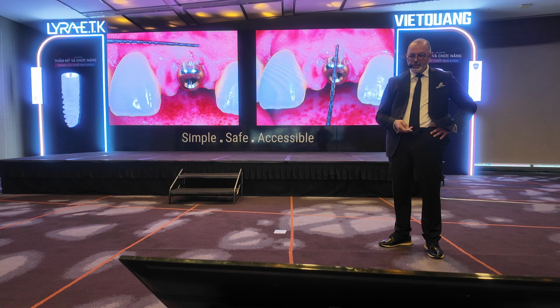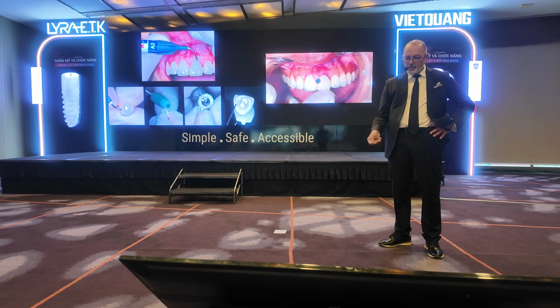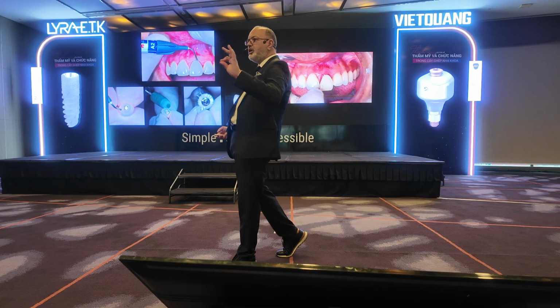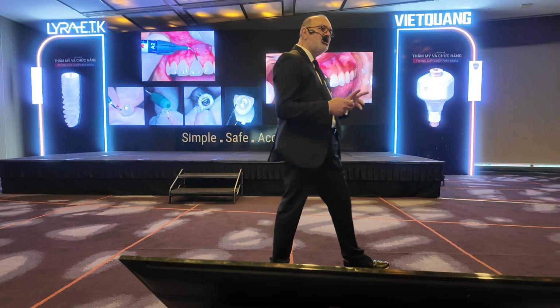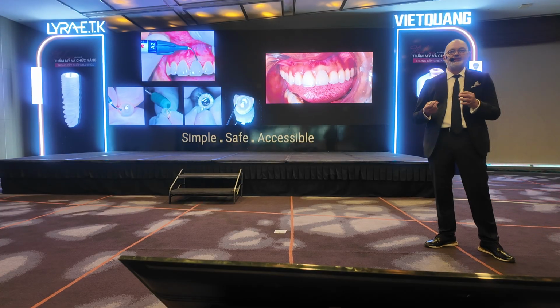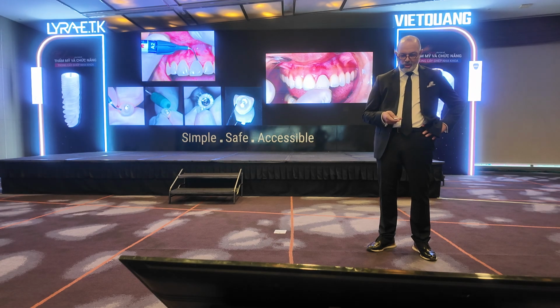So this is how we ended with the soft tissue, and you can see here when placing the provisional, we just click. Very interesting. Never any problem with the cementation, because this is really a problem when we did a super good job as a periodontist with graft, and then you come up with this sealing material which can really interrupt the job.